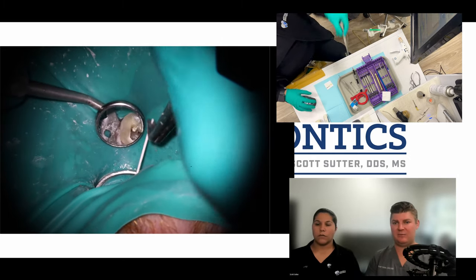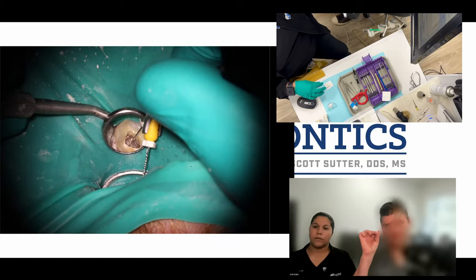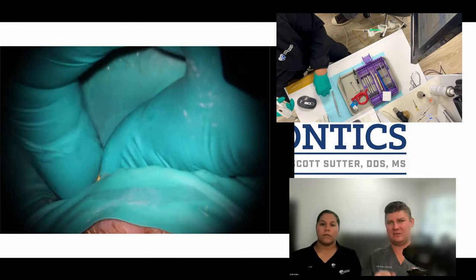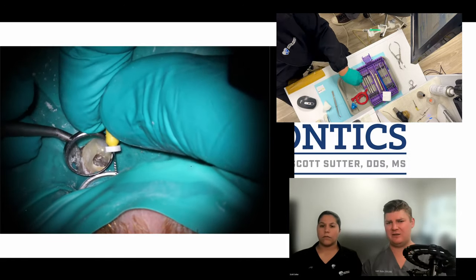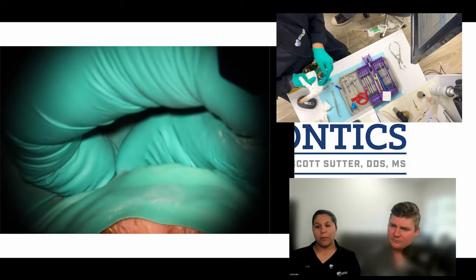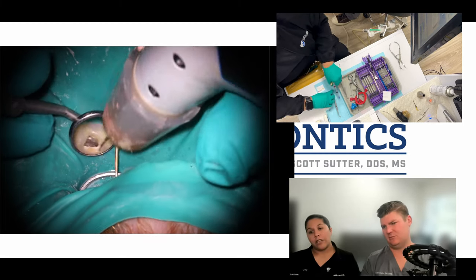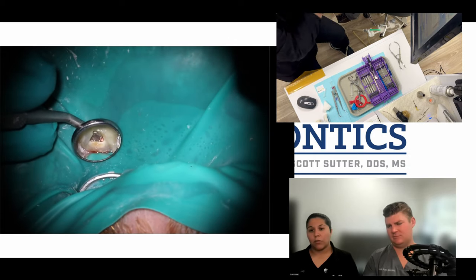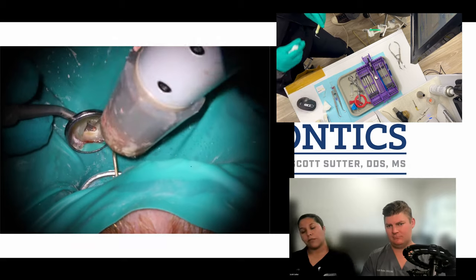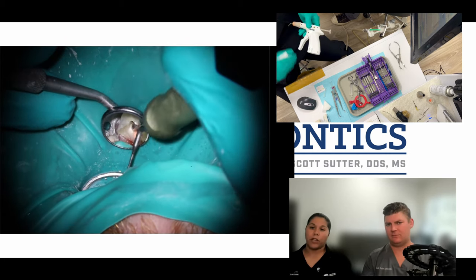Now we're doing the squirt technique — taking a little bit of AH Plus sealer down each canal using a paper point. She grabbed the 20 K file right there, which just makes sure we have a nice stable glide path all the way down. If there's anything blocking the flow of the gutta-percha it'll stop right there. Especially when I shrunk my sizes down to the 1704, it's nice to take that 20 K file down to working length and make sure there's nothing in the way, giving a nice path for the gutta-percha to reach the bottom. She's cleaning up the tray, removed the sponge from the endo ring, taken the needles off the syringe, and is now finishing notes and posting the root canal fees — even creating the claim.